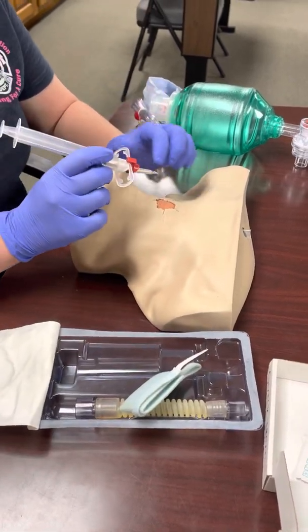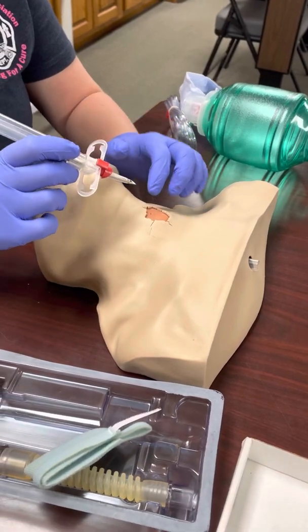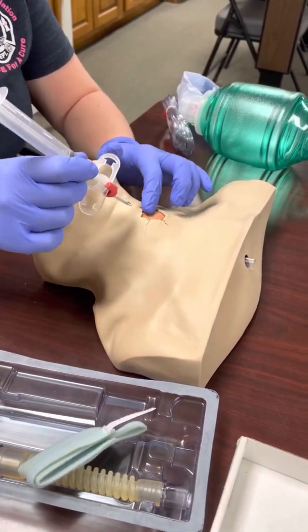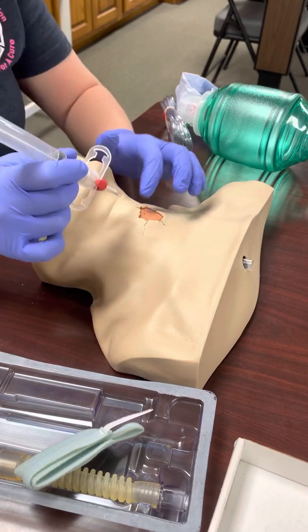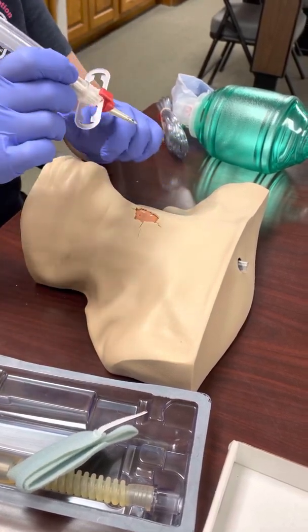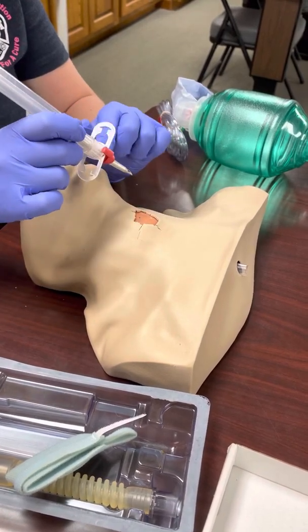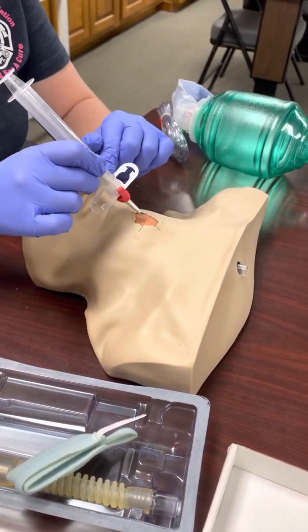Go ahead and take your introducer. Make sure that the red stopper is on there — these do kind of fall off sometimes. When you're going to introduce this to your patient, since you're sitting at the head, you want it pointing away from you. As you can see, it is curved, so once you break through that membrane it's going to have a natural curve down into the trachea.